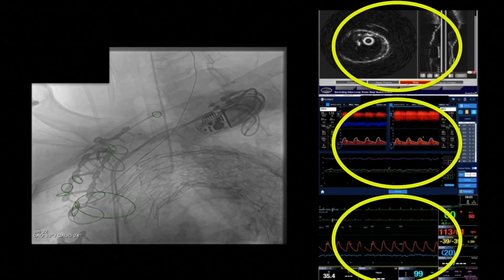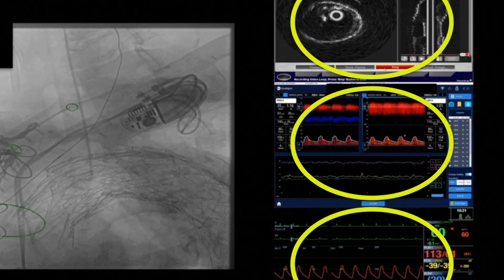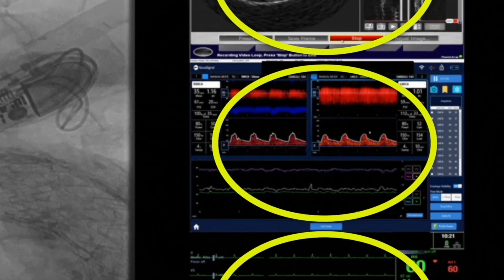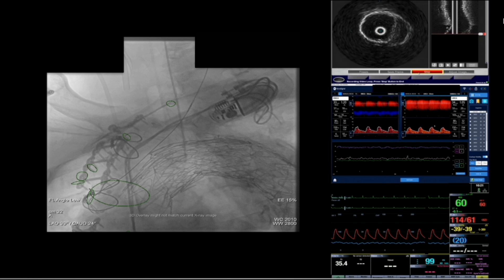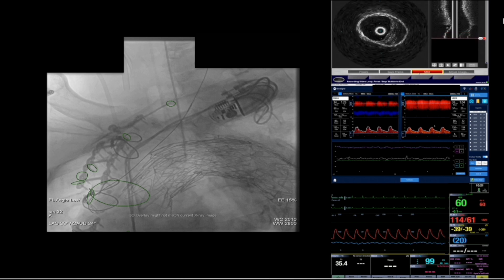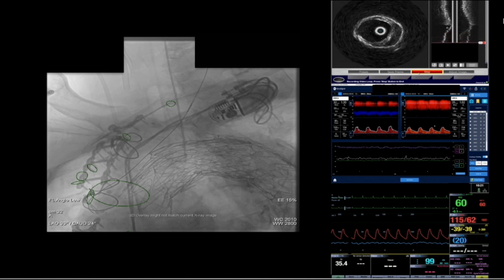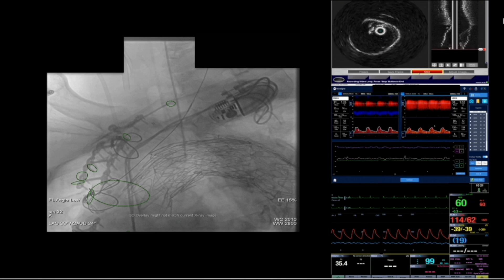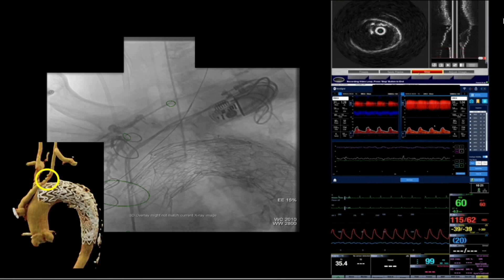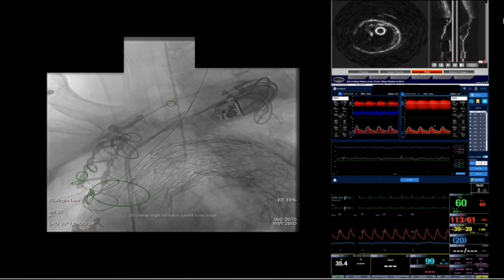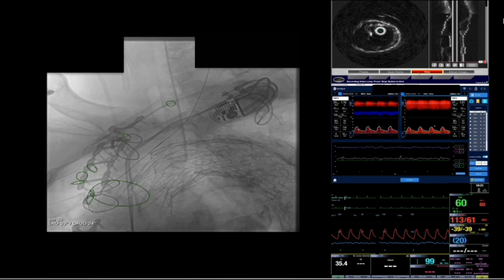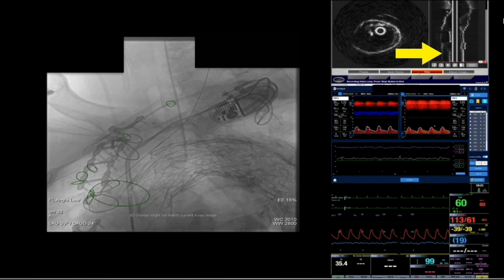During our case, we monitored the middle cerebral arteries on both sides with TCD. Since both the pre-op carotid ultrasound and TCD demonstrated delayed systolic upstroke on the left side, prior to T-VAR an attempt was made to restore proper flow dynamics by resolving the stenosis in the graft that supplies the left CCA and subclavian artery. As we see in the upper right corner, intraoperative intravascular ultrasound confirmed the narrowing of that segment.